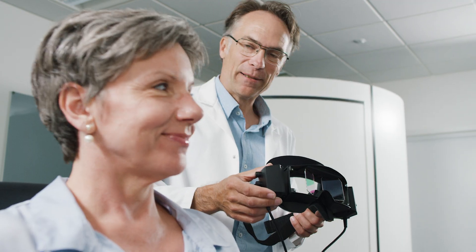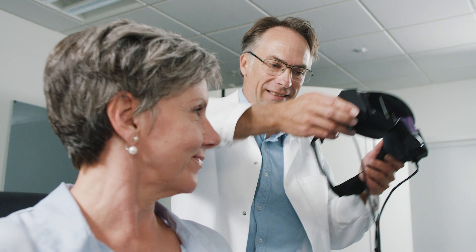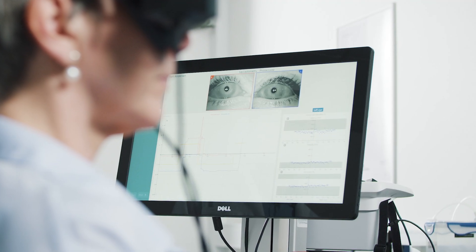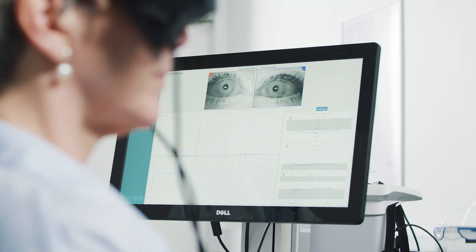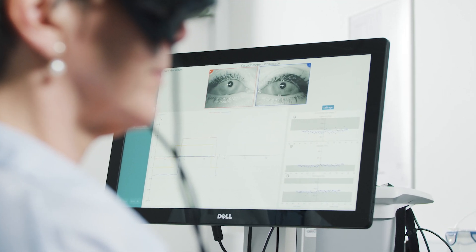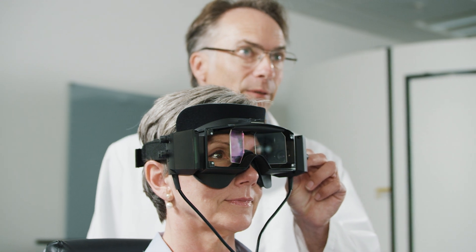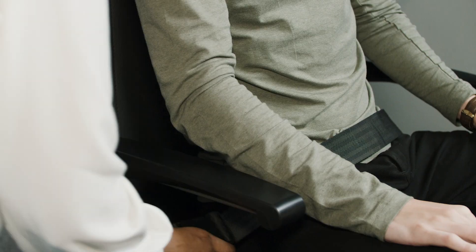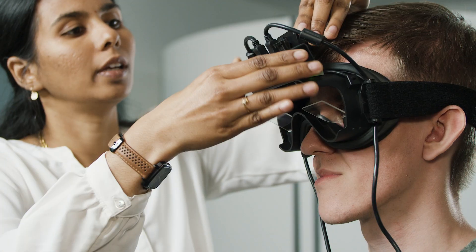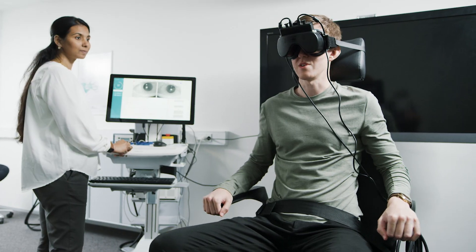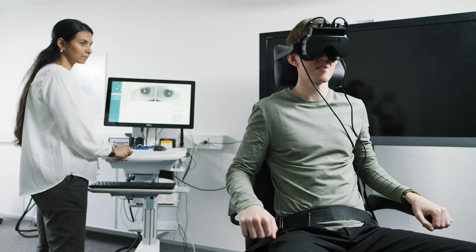Micromedical Visualize by Interacoustics is everything you need to perform gold standard vestibular testing. It is a comprehensive solution that combines software with a variety of VNG and VHIT goggles and rotary chairs that can be combined to suit the exact needs of your clinic.